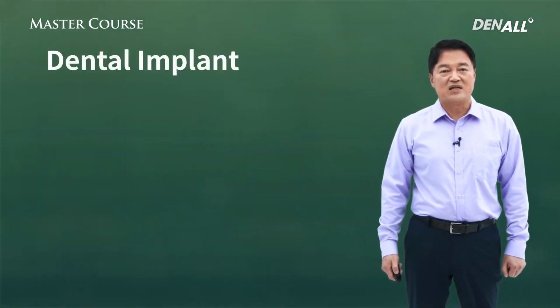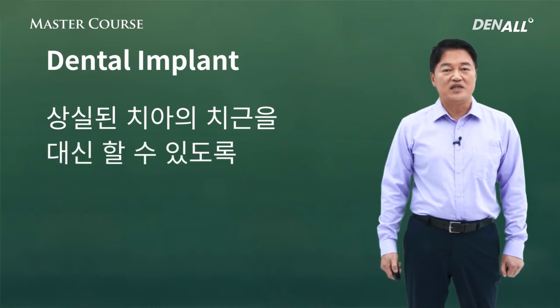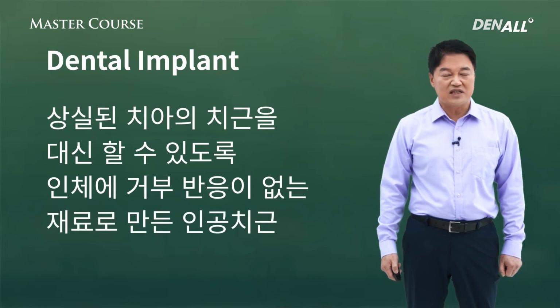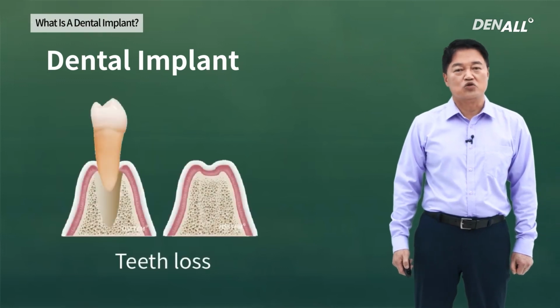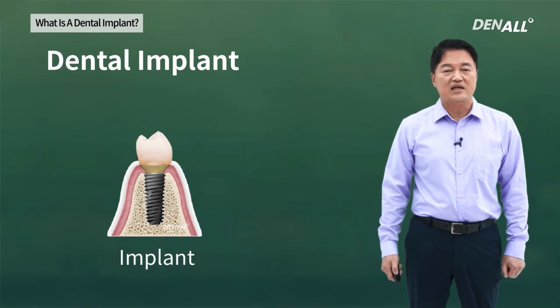Let's look at dental implant. It replaces the root of missing tooth, and our body does not resist this artificial tooth. If a healthy tooth due to caries needs to be extracted in order to restore it, we can use dental implants.